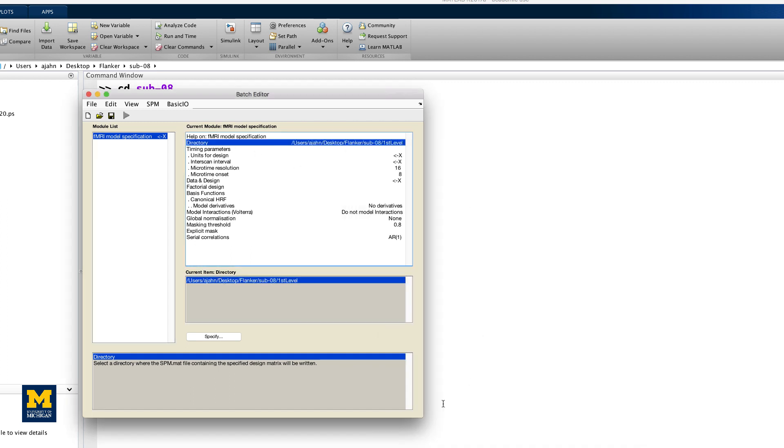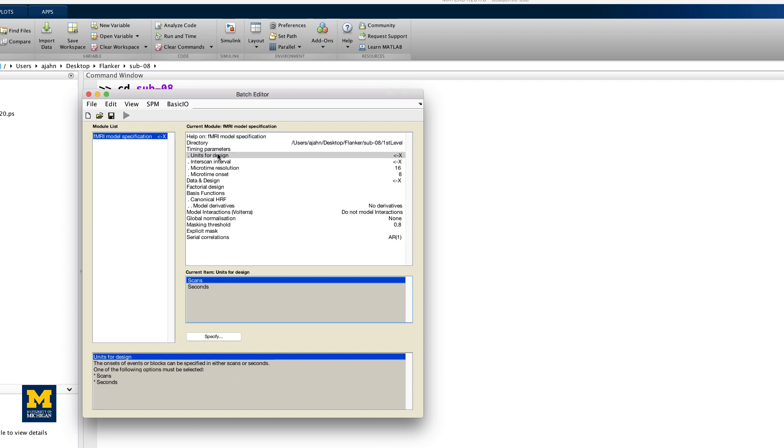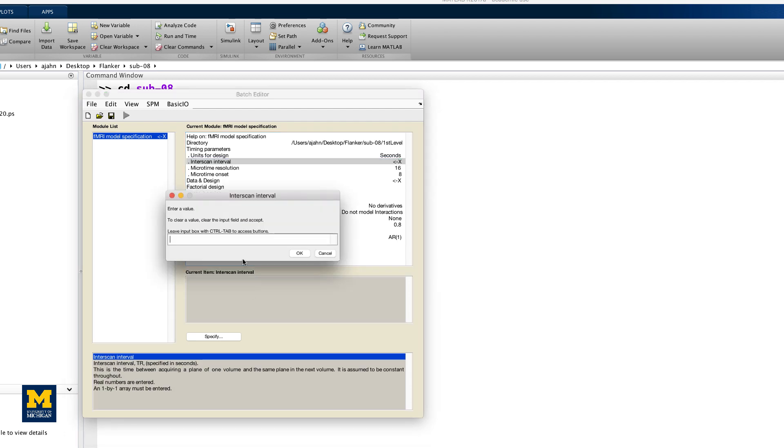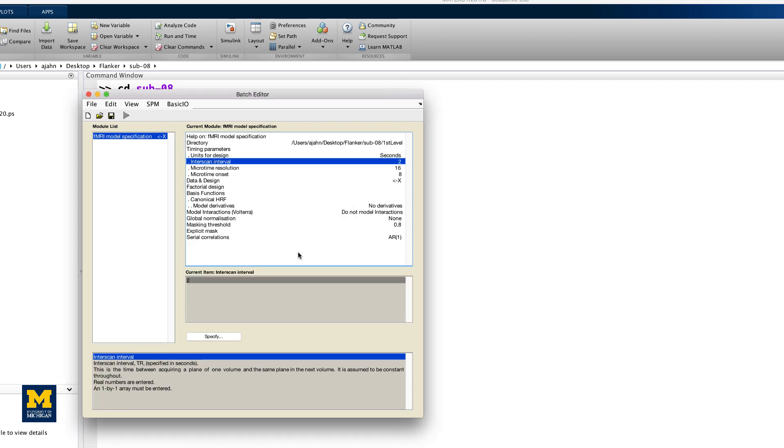All of the output of the first level analysis will go into this folder. Next, we will fill in the Timing Parameters section. Under Units for Design, select Seconds, and enter a value of 2 for the interscan interval, which is your TR.